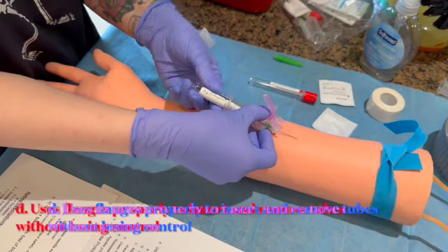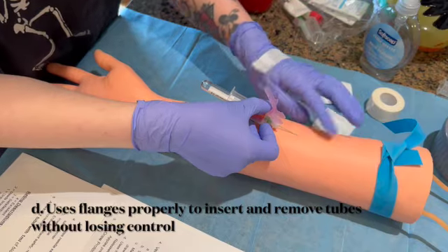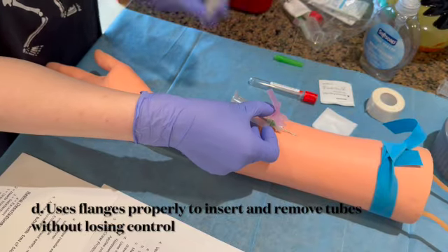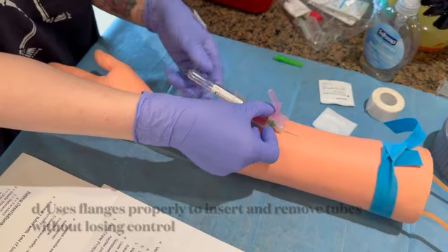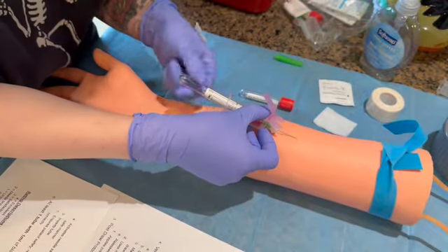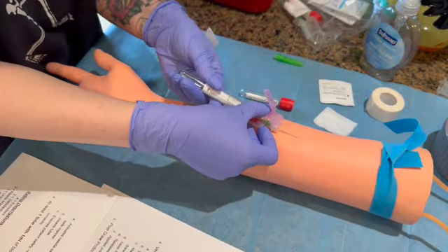But say we got our 1 milliliter of blood here. We got a little bit. We're going to need a little bit more. Actually, I don't know if I got it to him. And we'll get our 1 mil. And we got to grab our second one. So this is again with just the straight needle. We want to make sure that we are collecting 2 tubes at 1 milliliter each. It doesn't matter to me which tubes we last flow, which tubes is happening, just that you're collecting 2 of them and that they're each at 1 milliliter capacity.